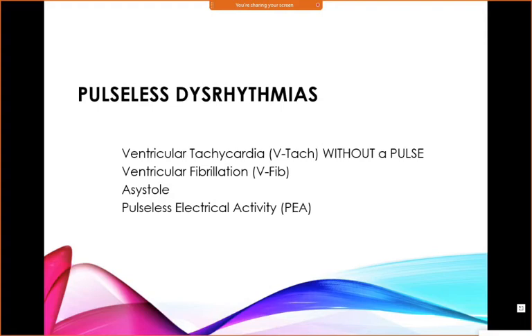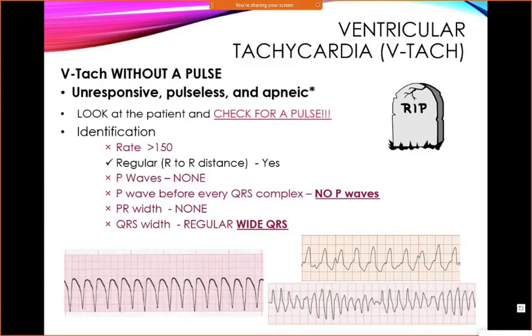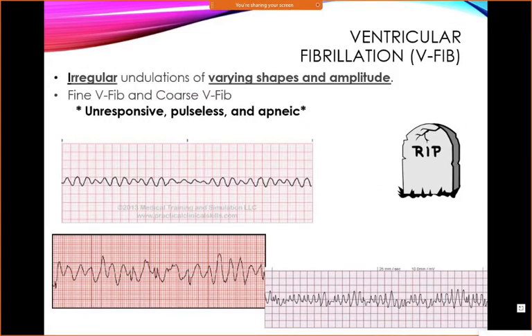Pulseless dysrhythmias, I'm just going to point out. So again, if you have a VTAC but no pulse, you have a pulseless rhythm. If you have any VFib of any kind, now you may want to call this one a VTAC, but it's not very tall. It's very kind of small. It looks almost like if there's just that atrium was doing its thing on its own. Any kind of VFib, they're called coarse VFib and fine VFib, but either way, it's not that regular.